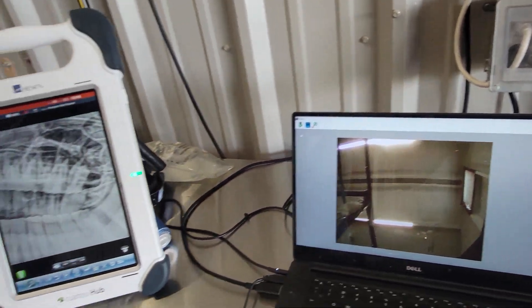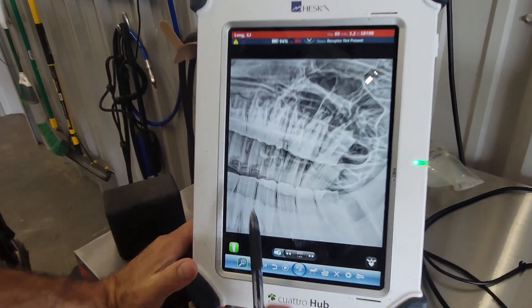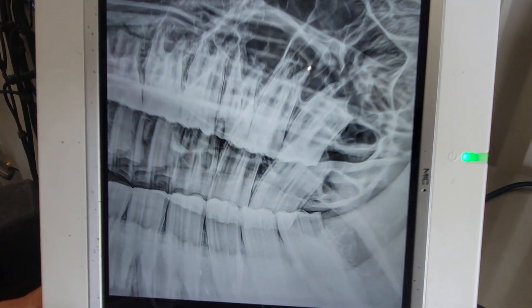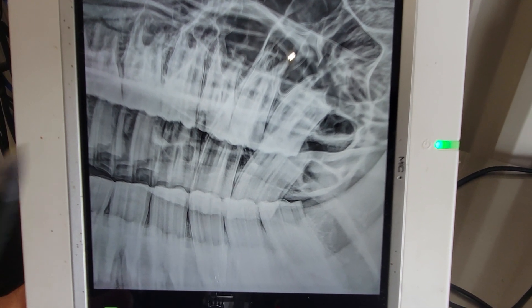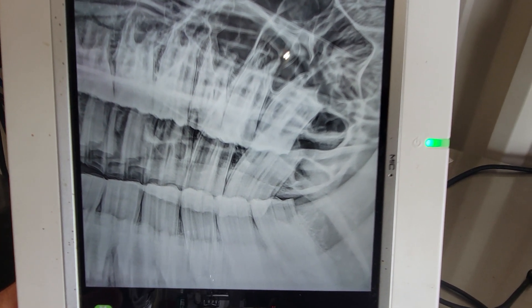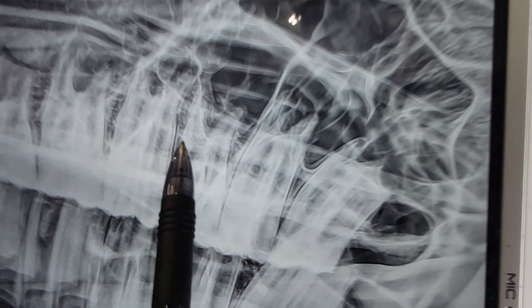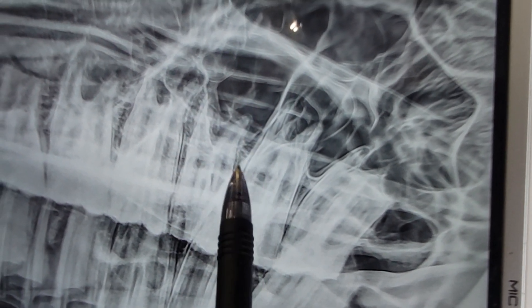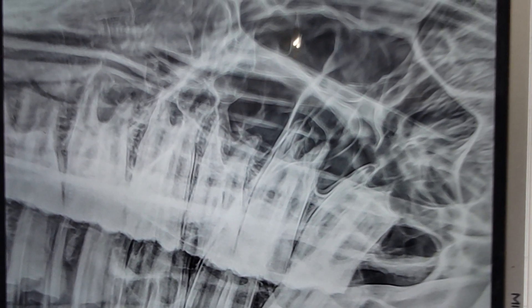Our next step is to take a radiograph. We did a lateral oblique dorsal to ventral radiograph, and that actually looks pretty normal. We'll zoom in a little bit and show you what these roots look like. On the number 9 here, this actually looks pretty normal. It might be a little bit hard to appreciate on video, but everything looks pretty good — we can see a nice lamina dura.